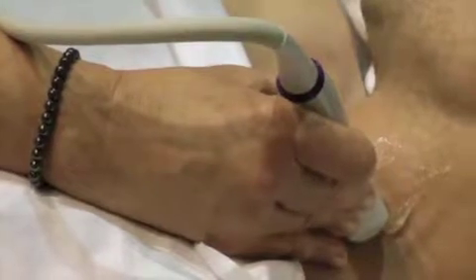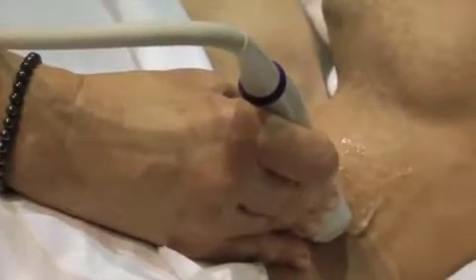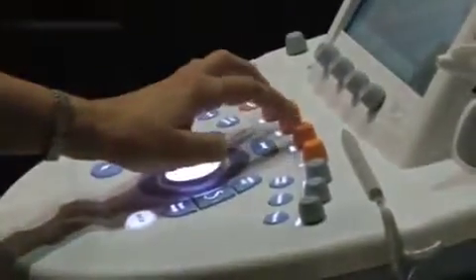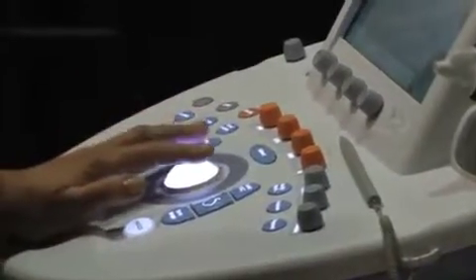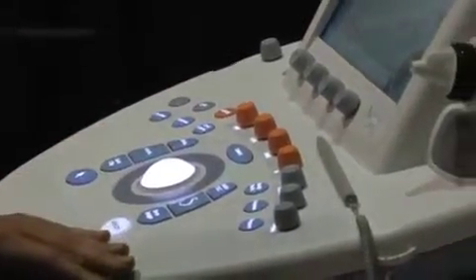I will now demonstrate how to perform a shear wave elastography exam in the thyroid gland. The first step is to perform a 2D image. I've now optimized my 2D image and I'm ready to turn on my shear wave elastography. Shear wave elastography is very easy to use — with just one push of a button, I have my shear wave window.